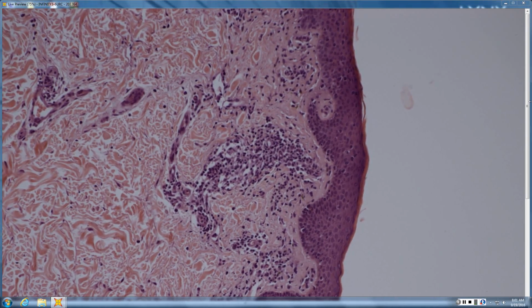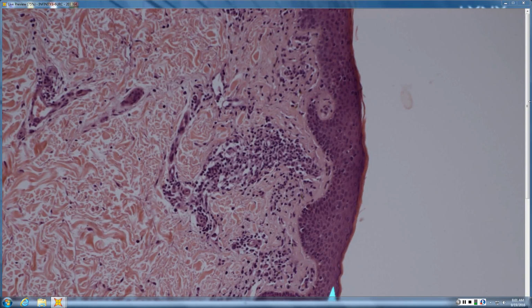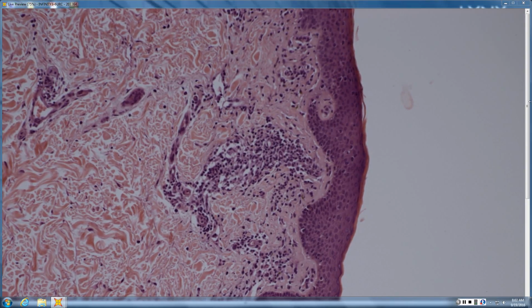So, MF, lymph in every hole. The lymphs in the epidermis are larger, darker, more angulated than the benign recruited lymphs below. Papillary dermal fibrosis, compact corneum, bare underbelly. Most benign infiltrates, the perivascular infiltrate is symmetrical, a circle around the vessel.